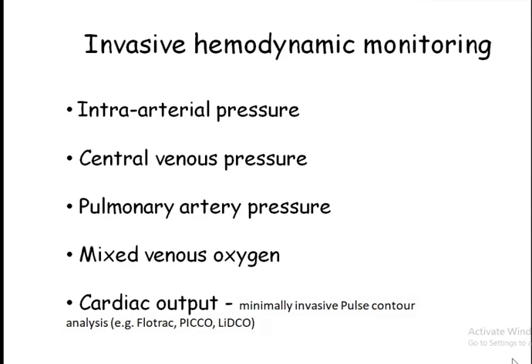So you can see what is the purpose of all of this. What is the purpose of all these monitoring we are doing? We want to see whether the tissues are getting adequate oxygen or not.